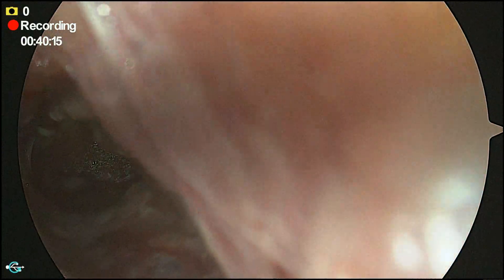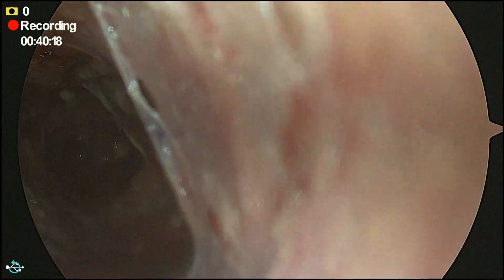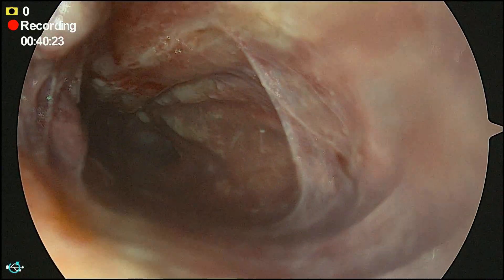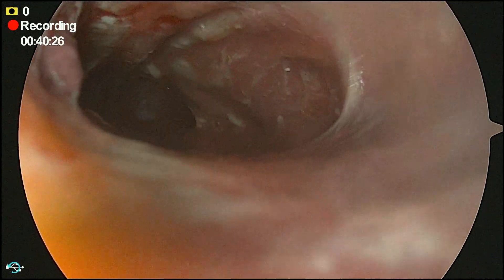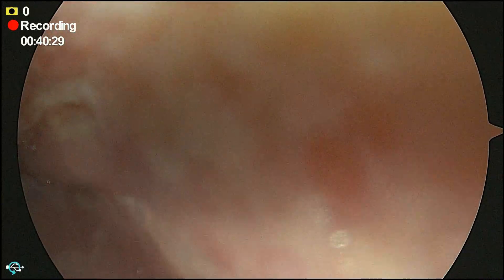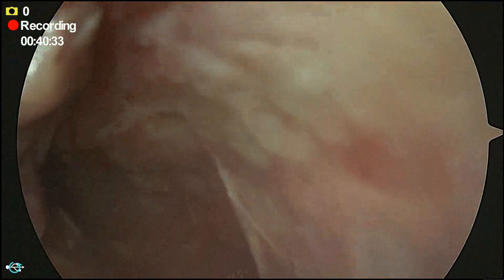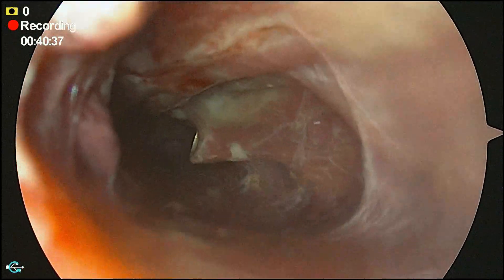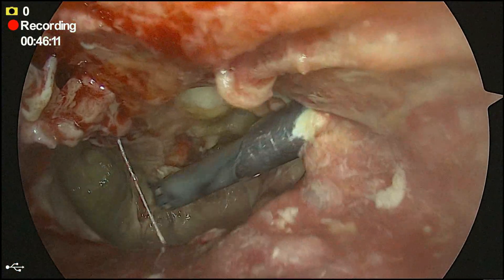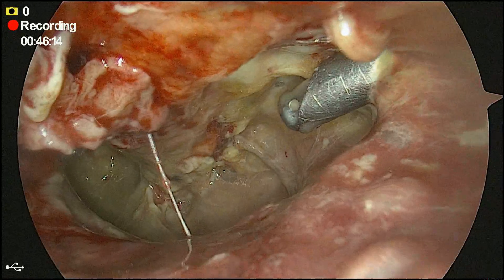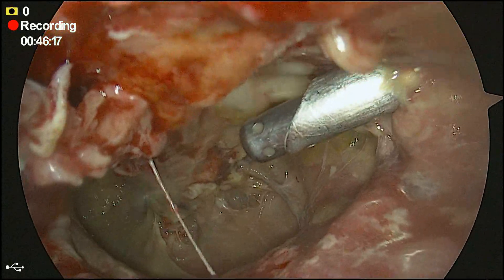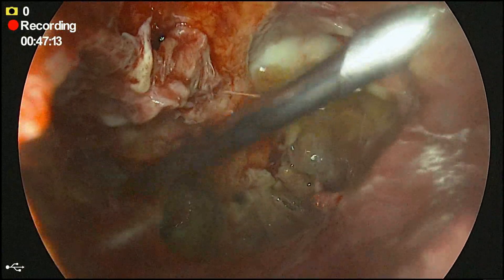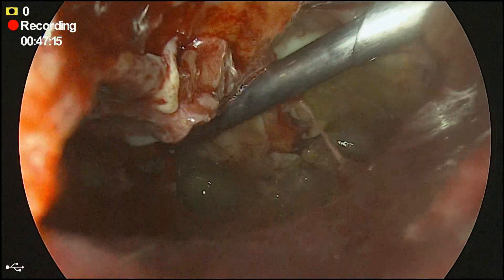Here we have entered the extraperitoneal space in a similar fashion to how we enter in a totally extraperitoneal repair while doing a hernia surgery. You can see I am trying to negotiate a 5mm cannula into the preperitoneal space, and you can see the purulent exudate which is present in this space. We have given a thorough wash and will be leaving a drain in the preperitoneal space.